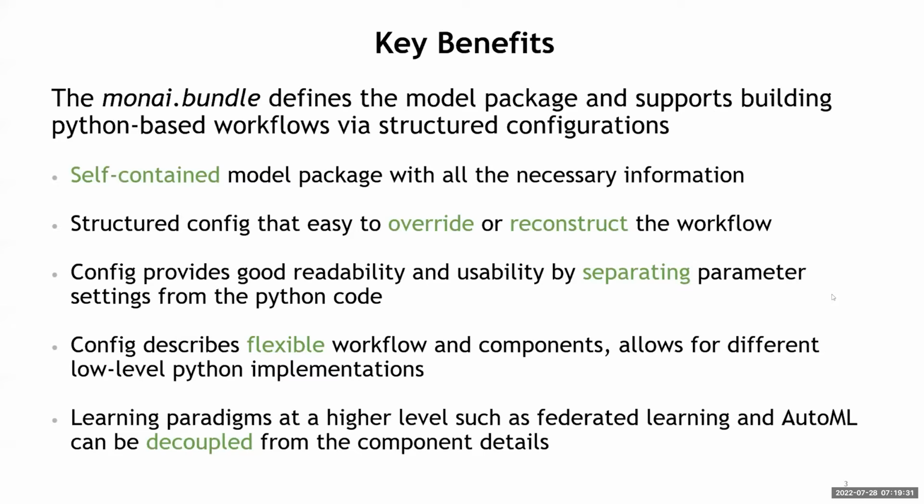So you look at what's inside this bundle, and it's meant to be a self-contained package, but again, it's meant to be additive. This is a package that is going to be zipped into a zip file, or can actually be stored as extra files in a TorchScript object for that matter. But the idea here is we want to include the semantic information and also include workflows. So other JSON files in the package describe specific workflows for training or for inference, and there'll be others for validation and for other application areas as well.